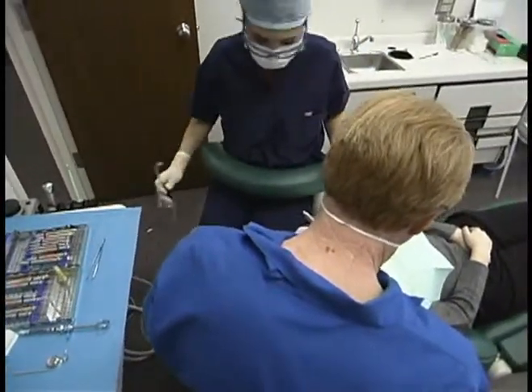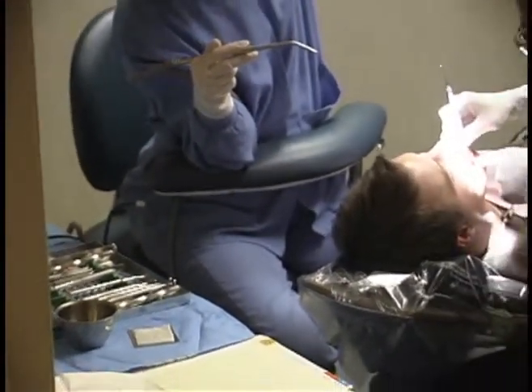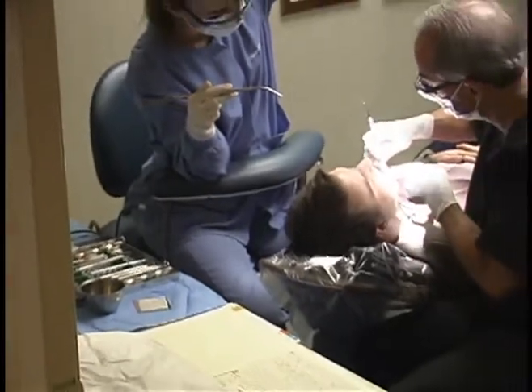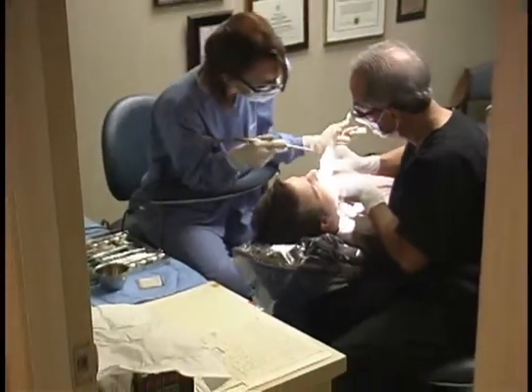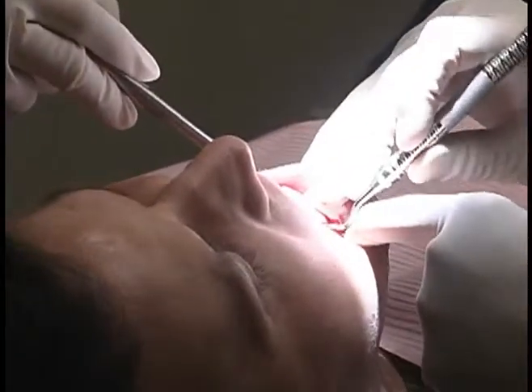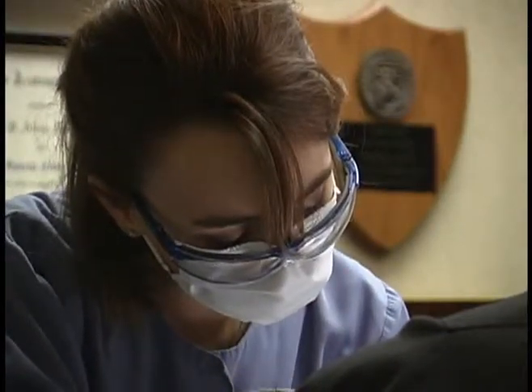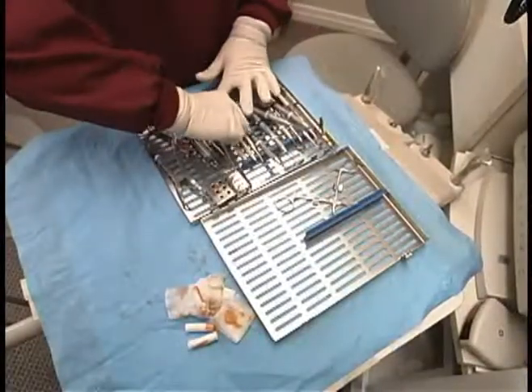We use the IMS system because of improved efficiency of instrument handling and for safety reasons. So the efficiency of handling means that all of our kits are set up with specific procedures, so that a grafting procedure is one particular kit, and those instruments stay in a particular order in that kit. And when they're used at chairside, I know what will be on hand for that procedure, and the assistant does too. So setting up is faster and more efficient, and use of instruments during the procedure is more efficient.